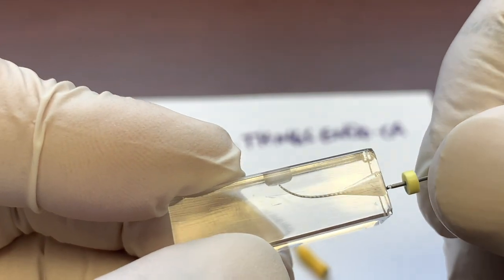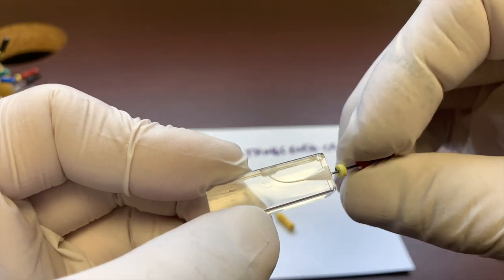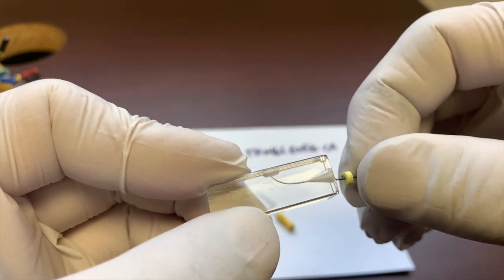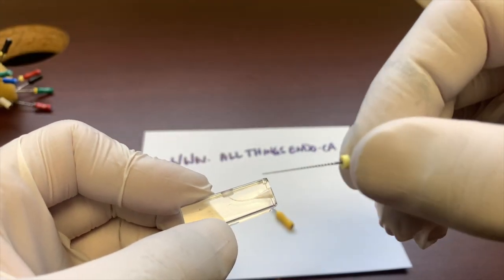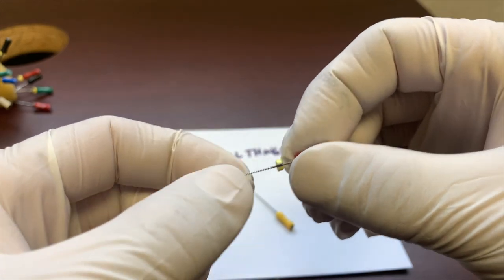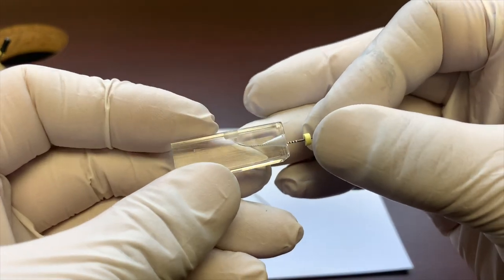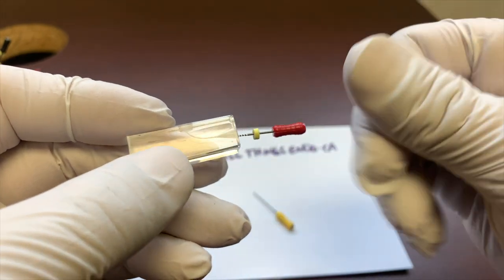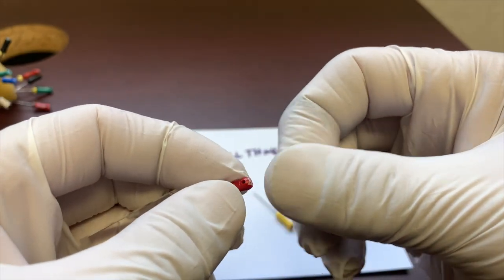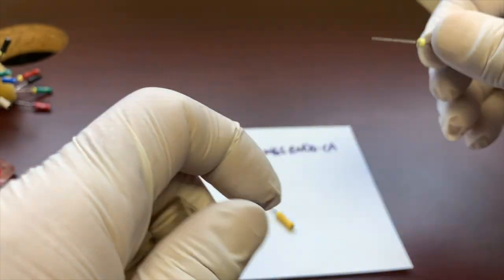So let's do one more cutting cycle. You'll hear the clicks. There's cutting, and more debris on my file. You can see that there. Now, in that article, it talks about what some of the clicks are. Most of the time, if you're doing it properly, the clicking is the cutting of dentin. Another reason you might hear clicks is that the gloves are snapping, and the other one is that you just broke a file.